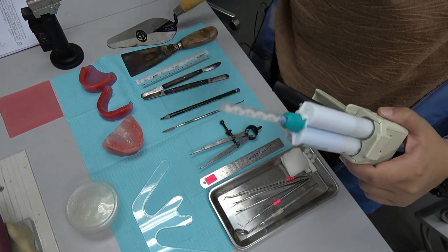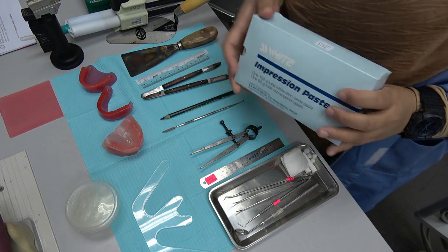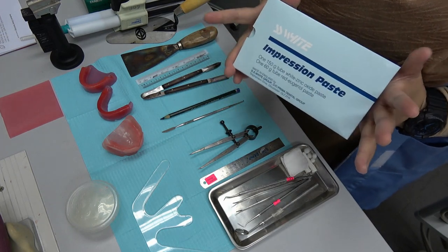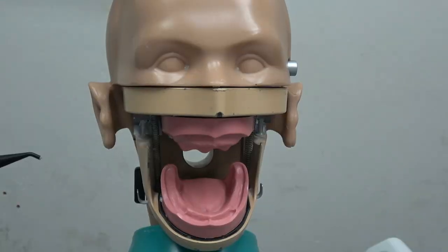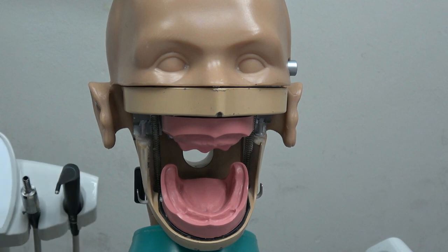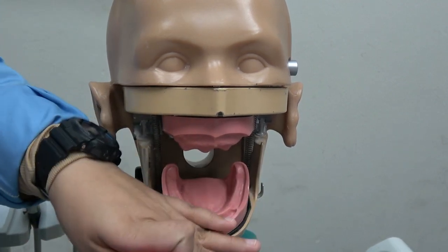If you have to redo, then you have to use the other material outside. So make it right on your first attempt. For the MMR, we need the jaw, so you have to mount it in the phantom head.